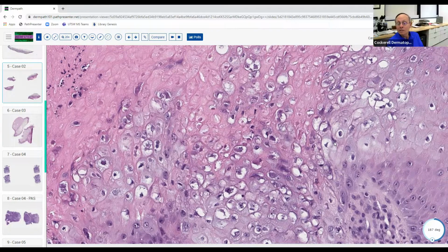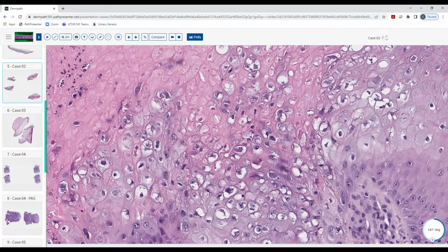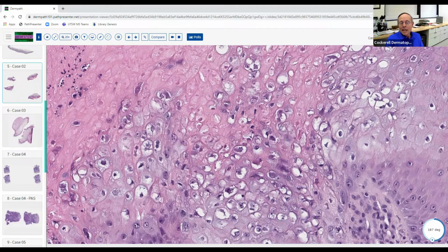Yeah, acantholysis, like pemphigus and focal acantholytic dyskeratosis, Darier, that sort of thing. Of those three, which one are we looking at here? I think this is ballooning. Good. This is ballooning degeneration. And when you see ballooning degeneration, again, we like things that have short differentials. What are some of the things that can cause ballooning degeneration?